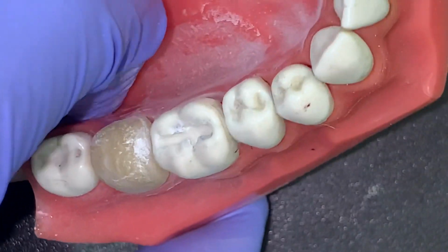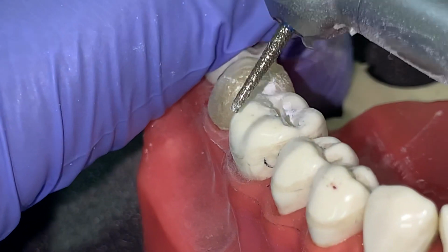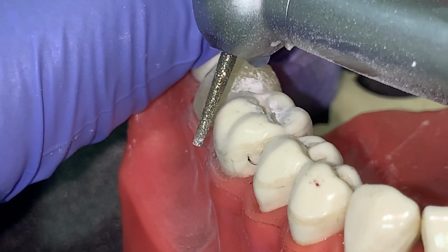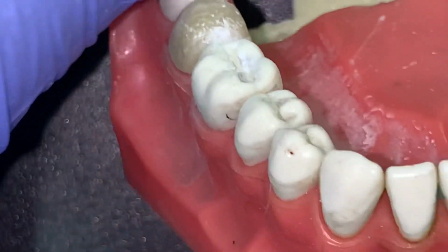So what I do is, I just make a rough class 1 kind of cavity to an initial depth of 1.5 millimeters approximately. Here we are using a flat ended burr.